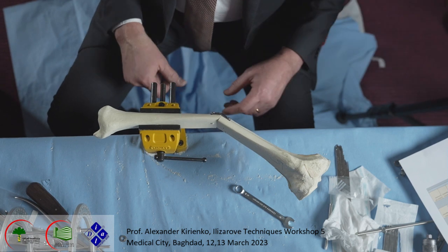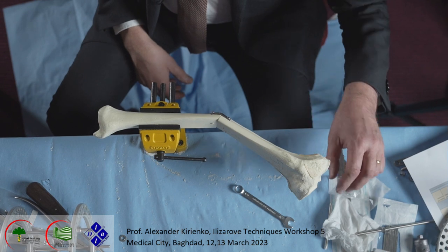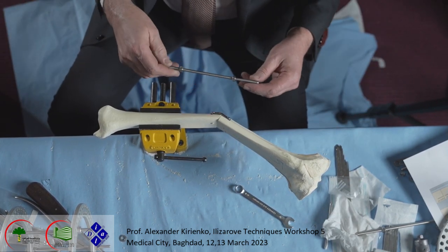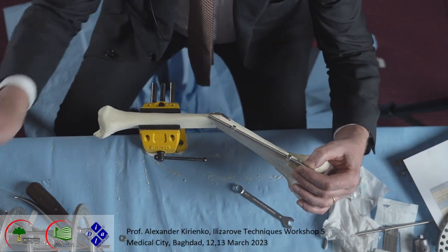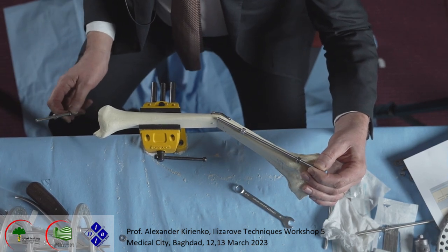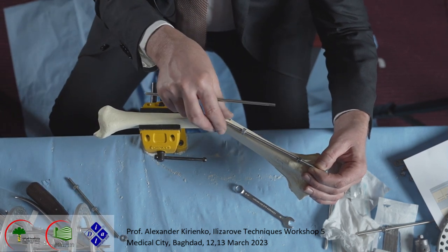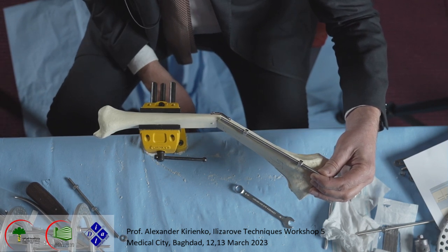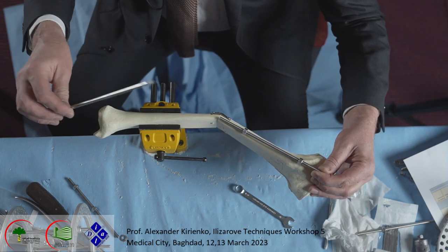What we need to know here are important things to understand where we have a deformity. What we do in the tibia is a little bit simple, because you need to design the proximal part of the tibia, and like I said before, the mechanical axis and the anatomical axis of the tibia overlapping.